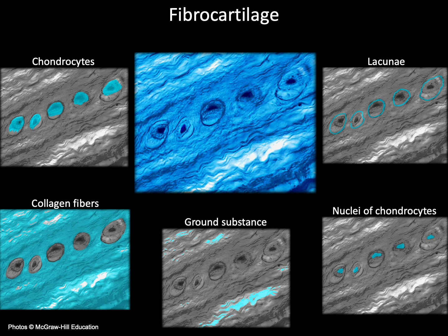In this diagram, you don't really see the collagen fibers stained so well. I guess you can see a little bit of the wave to the fibers in certain areas. It's an interesting photo. I've never really seen this one before, but you should see where there's a little bit of the wave of the collagen fibers. But there are other diagrams out there where we can see these just a little bit better.